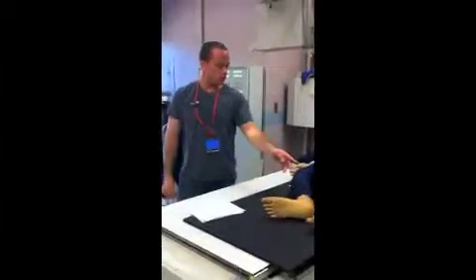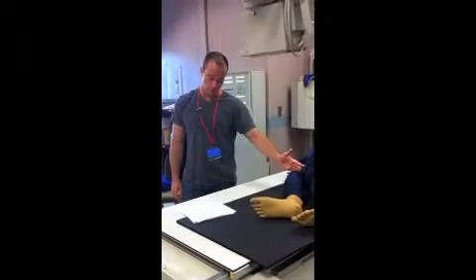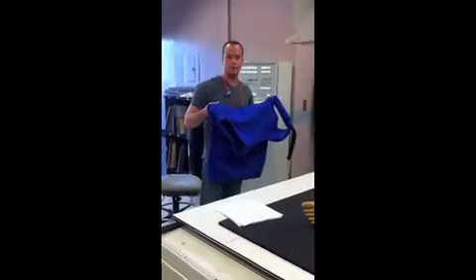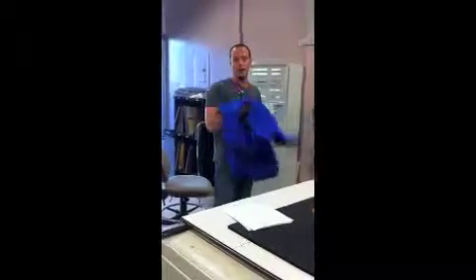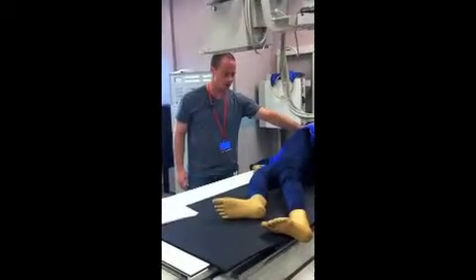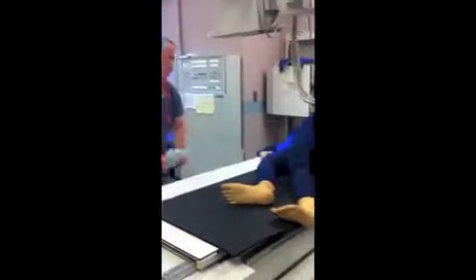And the central ray also enters 1 inch distal to the medial epicondyle of the knee. Again, my technique is going to remain the same, 65 and 5, because the lateral width of the knee is roughly the same as the AP width of the knee. So I'm going to remain at 65 and 5. I'd be better about correctly shielding a patient in the actual clinical, but this guy's hard to keep in position, so this is going to have to do. Okay. Ready to take the exposure, don't move.